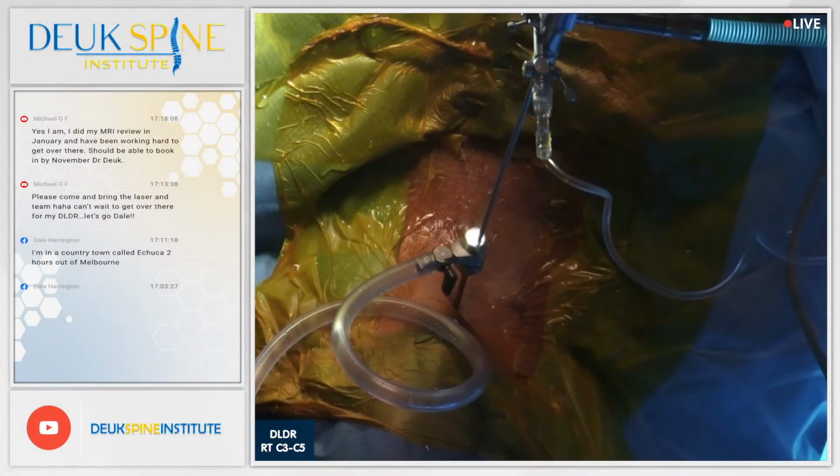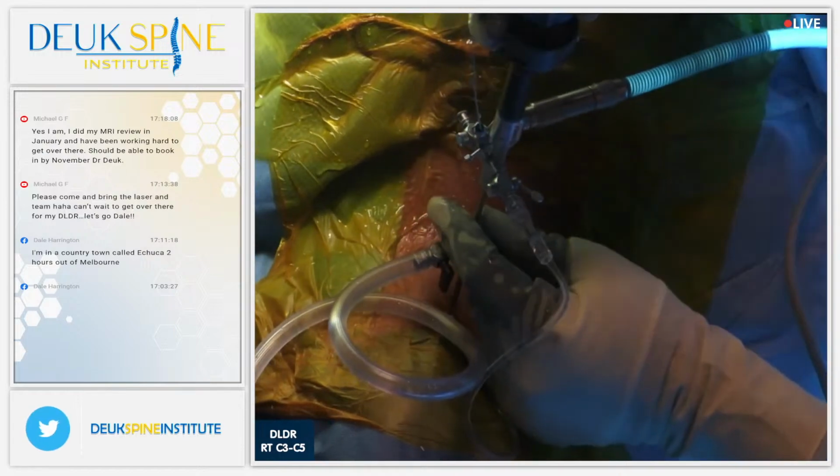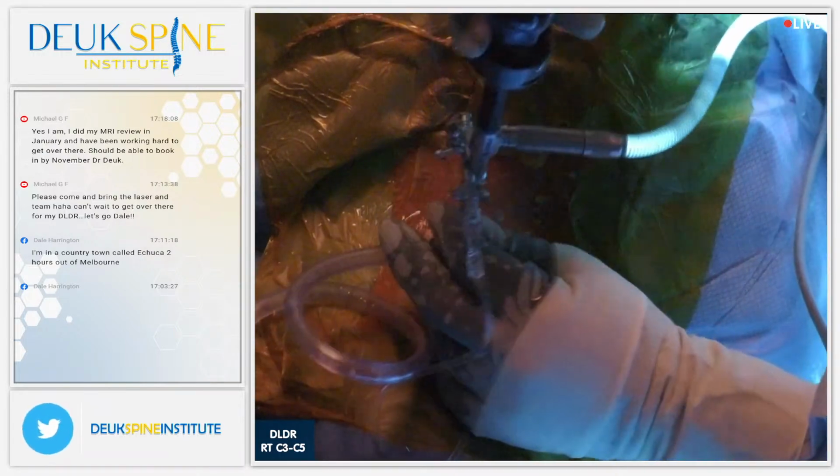Irrigation is very weak. Why? Get that fixed. You guys got to be paying attention to that irrigation. Something wrong.